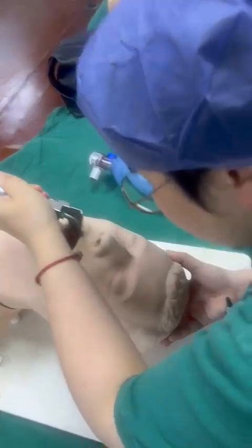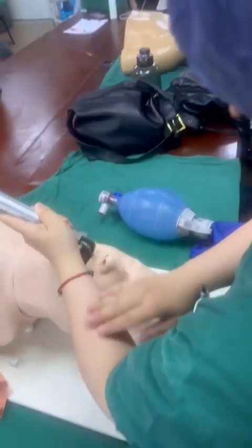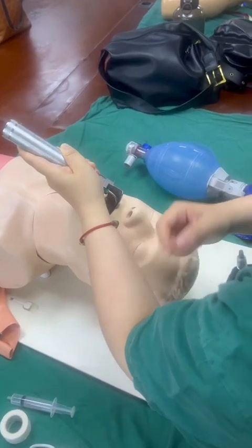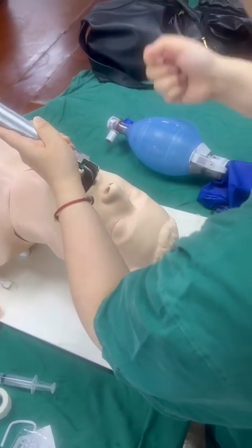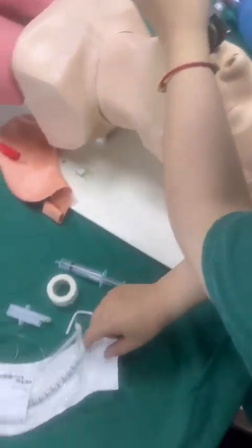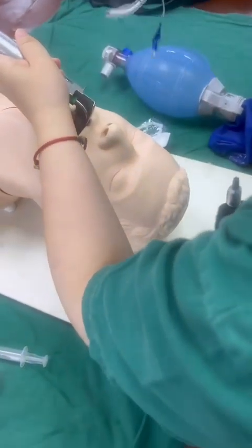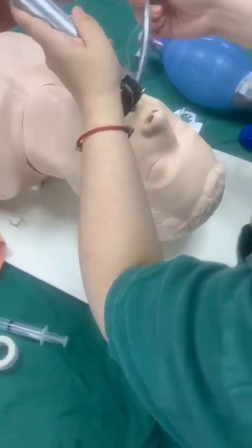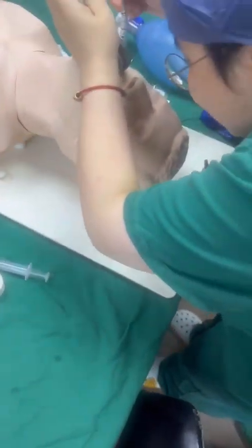A little, and we lift our forearm to lift it. Don't rotate the wrist. When we see the glottis, we can do the tracheal intubation. Also insert from the right side of the mouth. A little. Yeah.